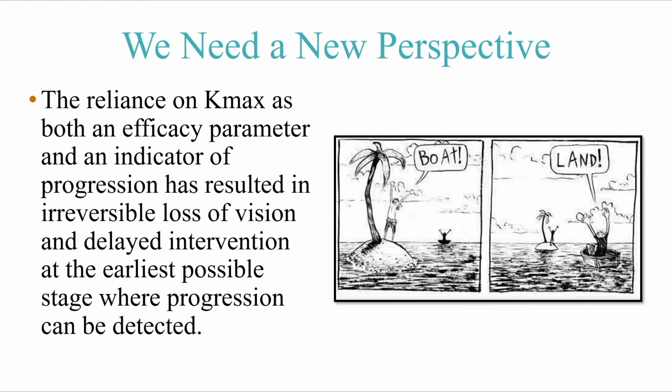And again, that would be like looking at a patient with glaucoma and saying, well, the pressure's 25. We're not treating you until it gets worse. And that's not how we treat disease. The goal should not be to treat after you've had damage. It should be to prevent the sequelae of disease. And that you can't do if you rely on the anterior corneal surface.